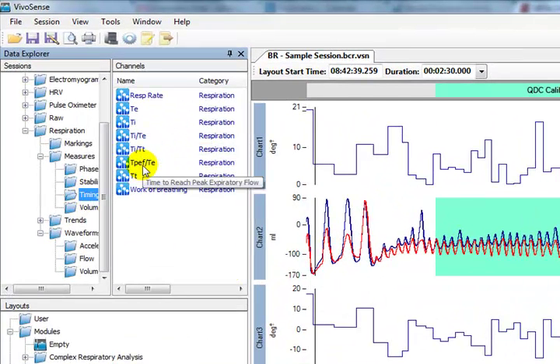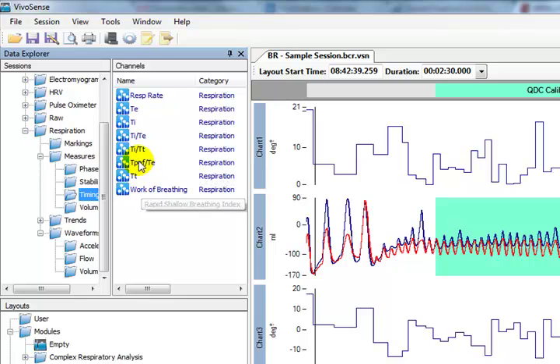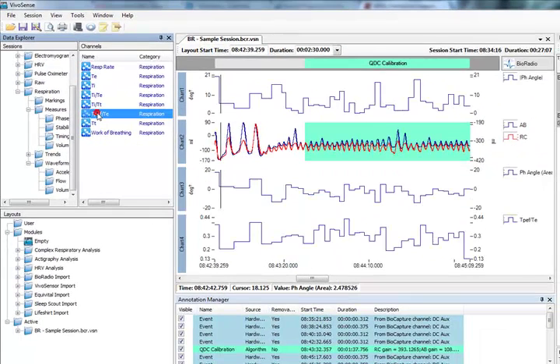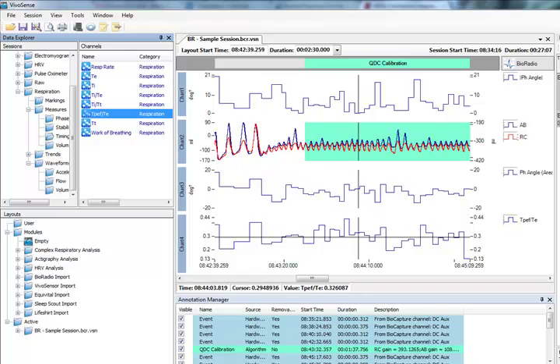Respiratory timing channels allow us to view measures related to the timing of breathing, such as respiration rate and work of breathing. The TPEF over TE timing is a time to reach peak expiratory tidal flow as a percentage of expiratory time. We can visualize this alongside our other complex respiratory measures in VivoSense synchronized chart panel. Now let's empty the chart panel and bring up our tidal volume and inspired tidal volume again.